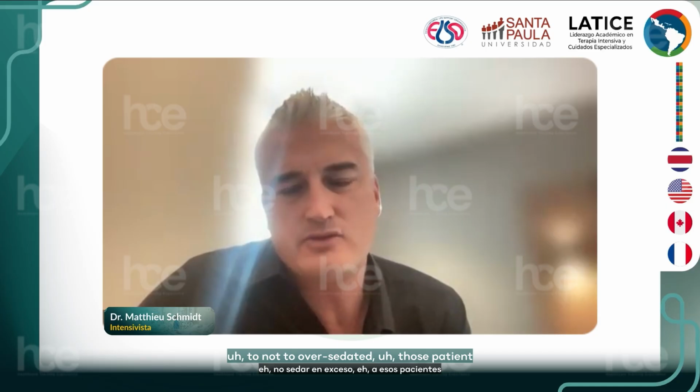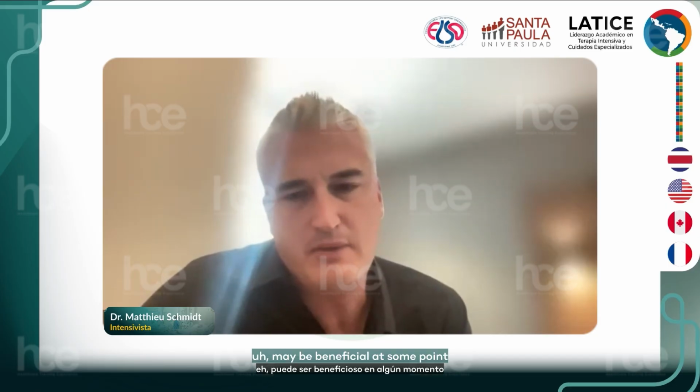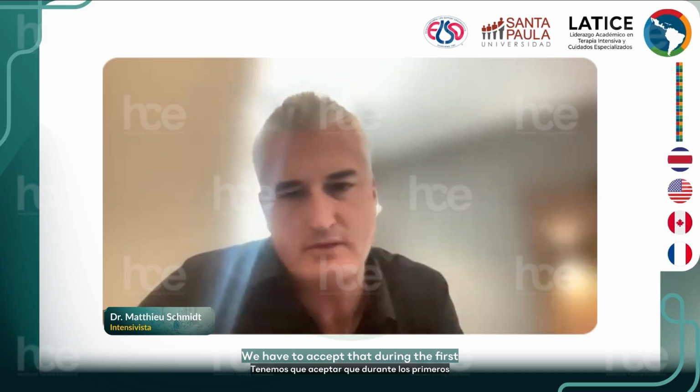And the second point, on ECMO for the management, I will say try not to over sedate those patients. It's not because it's a very sick patient that he has to be deeply sedated. And promoting spontaneous breathing, active rehabilitation may be beneficial at some point, probably not early on. We have to accept that during the first days or even the first week, the patient has to be deeply sedated to perfectly rest the lung.